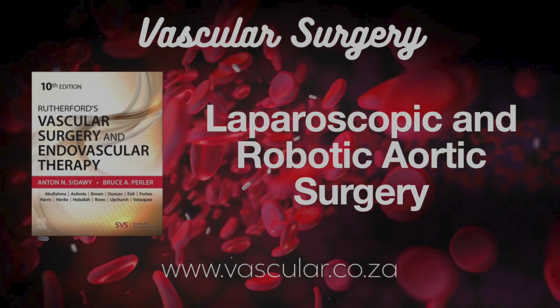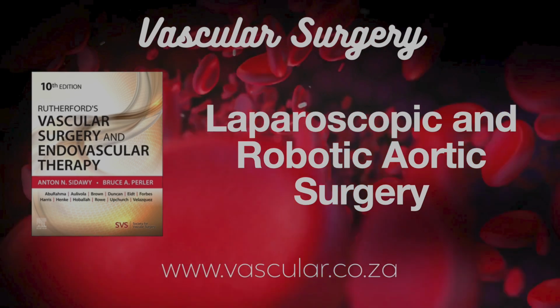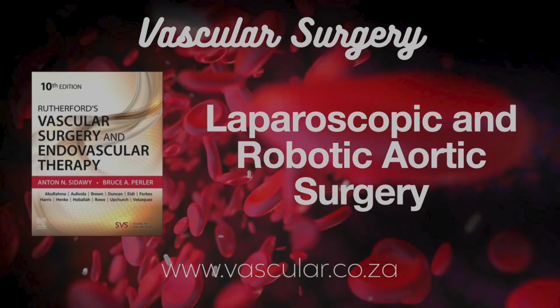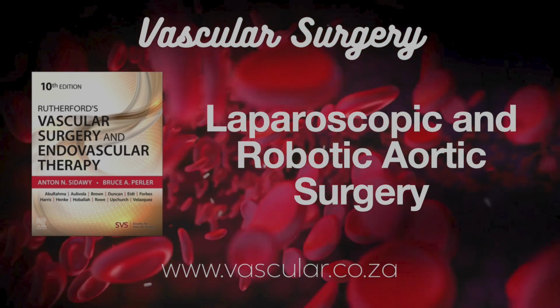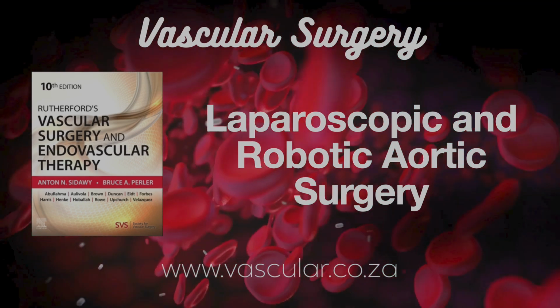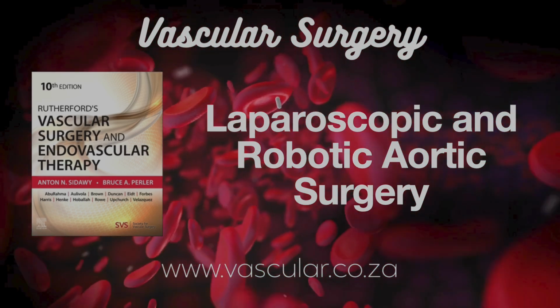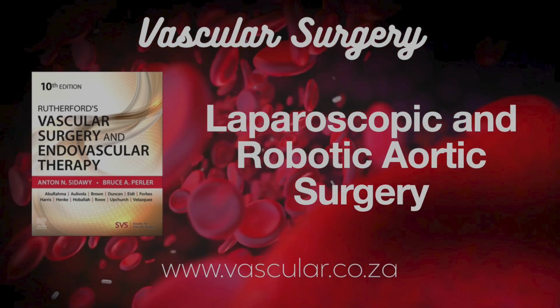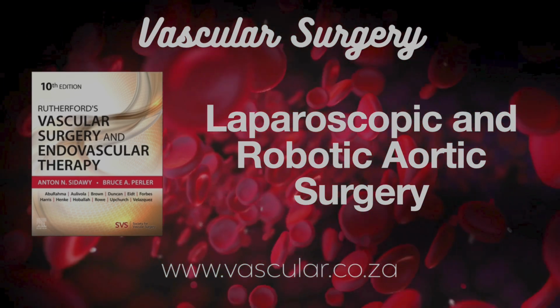Or sometimes they use automatic staplers. The book mentions the Endopath ETS Flex 45. Staplers for the aorta. Yeah, but the aortic wall needs to be relatively healthy, not too calcified or hardened for the staples to work well. Can save time, though. Makes sense. Yeah. And connecting the graft down to the legs.